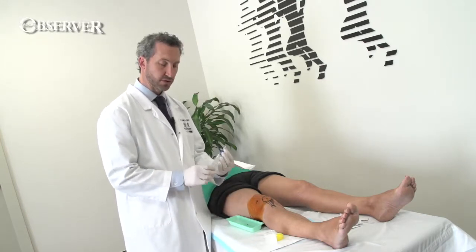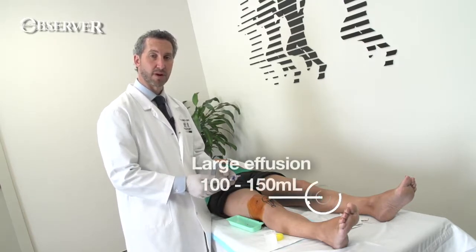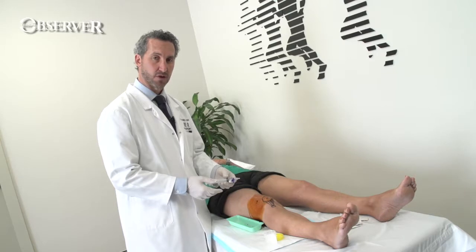Even with a 20ml syringe, you're probably going to do this at least four or five times, because you should be getting 100 to 150ml of fluid out of the knee with a large effusion, and that will make the patient feel a lot better.